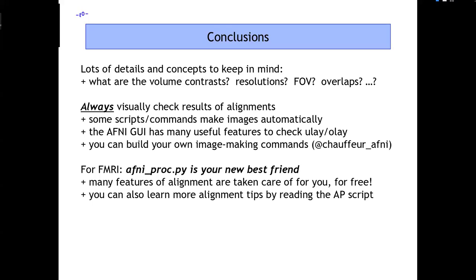If your EPI is very distorted, there's only so much affine registration or anything is going to do to put your data where it should get put. Also, even for nonlinear alignment, sulcal and gyral features differ across subjects and between subject and a template. So really have these things in mind and use that to be discreet with your interpretations, to not overinterpret misalignment or just heterogeneity of features across subjects.